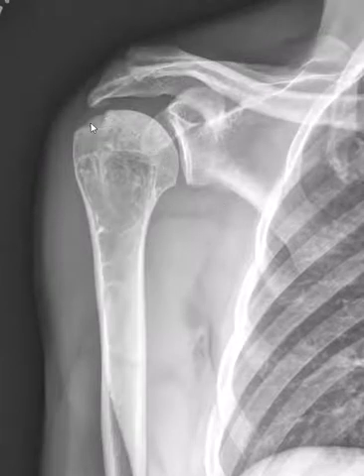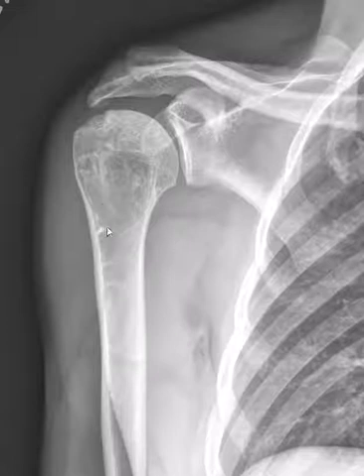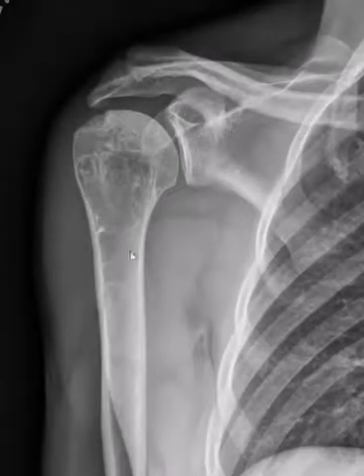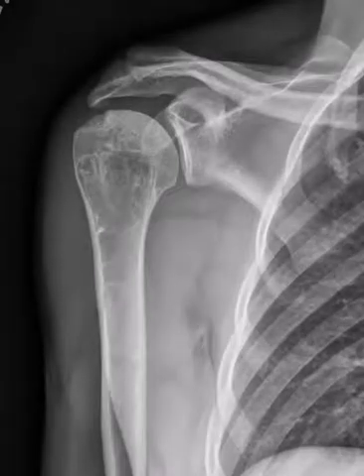There's a subarticular region of abnormal density here, some geographic subtle area of lucency, and these funny little scattered areas of bone sclerosis — kind of a whorled appearance — and the diagnosis based on this was fibrous dysplasia.